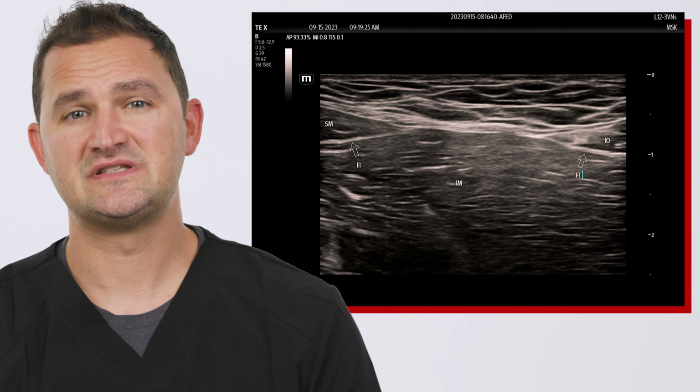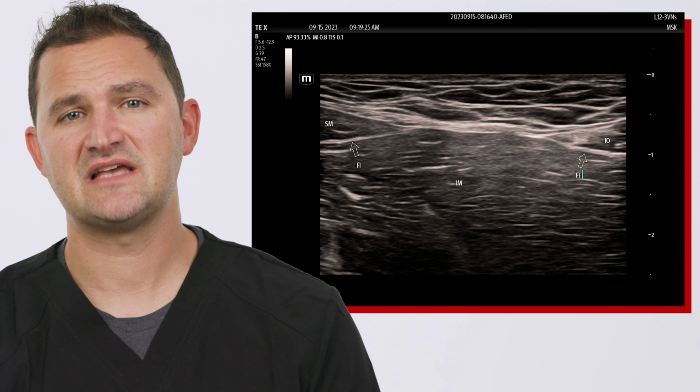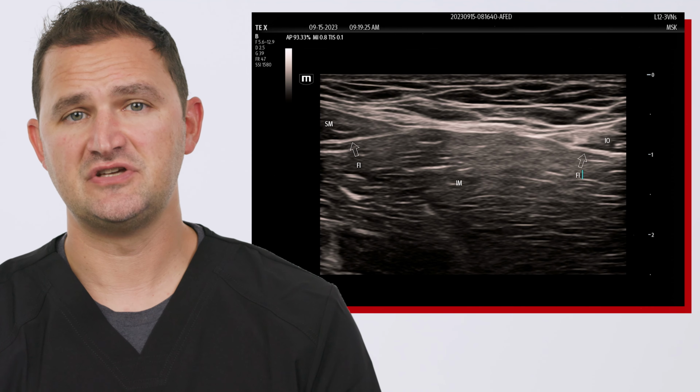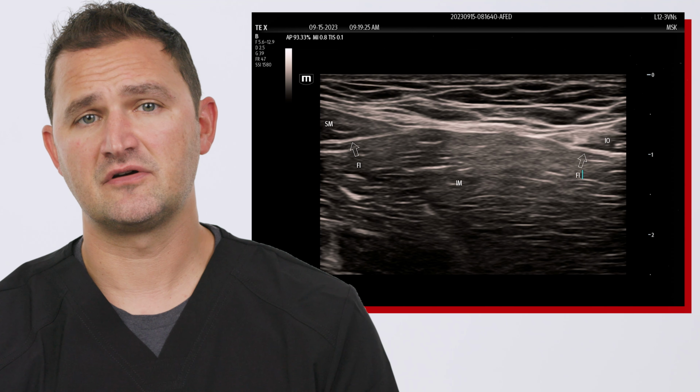This local anesthetic will dive over the iliacus muscle, cephalad, and it bathes inside the pelvic fossa. This is where all these nerves originate from, such as the lateral femoral cutaneous nerve, the femoral nerve, and also the obturator nerve. And this is how you're able to get all three of these nerves, by pushing this local anesthetic cephalad, getting this local anesthetic up into the pelvic fossa.